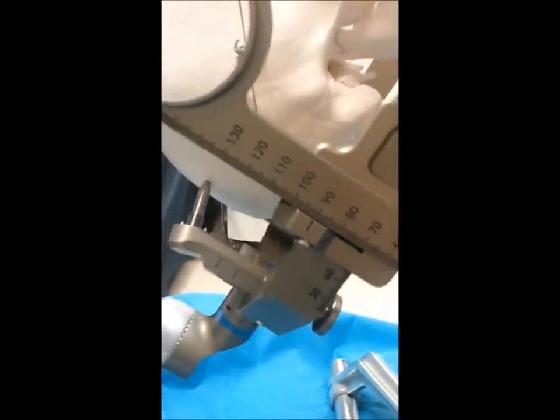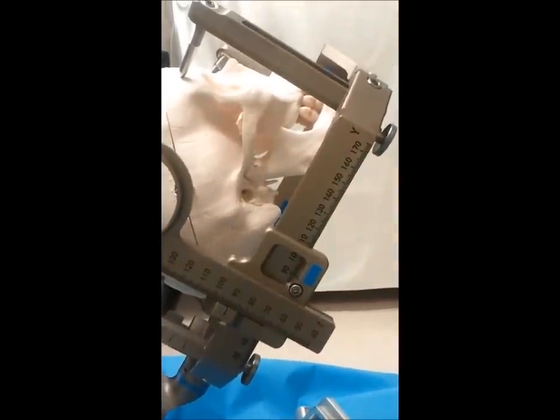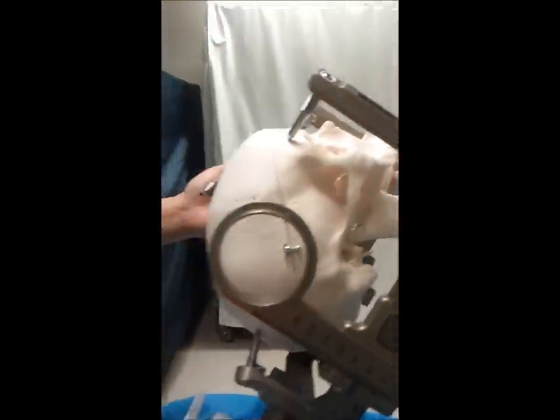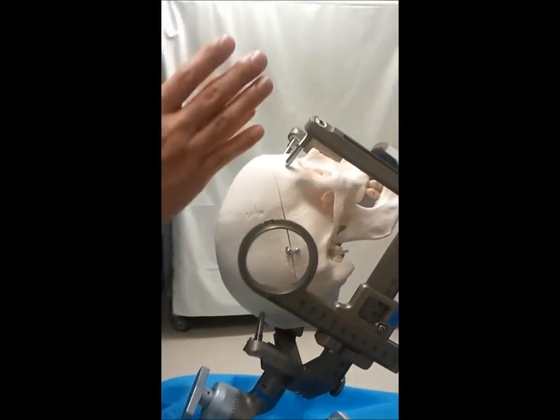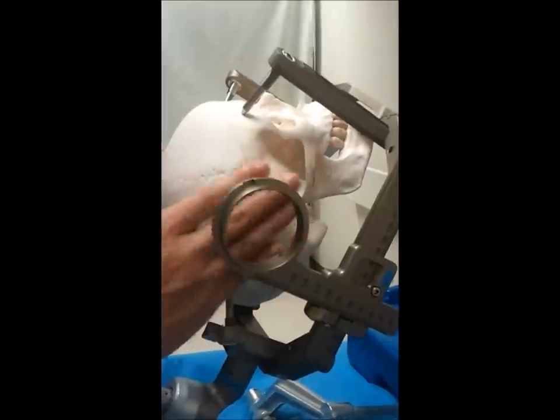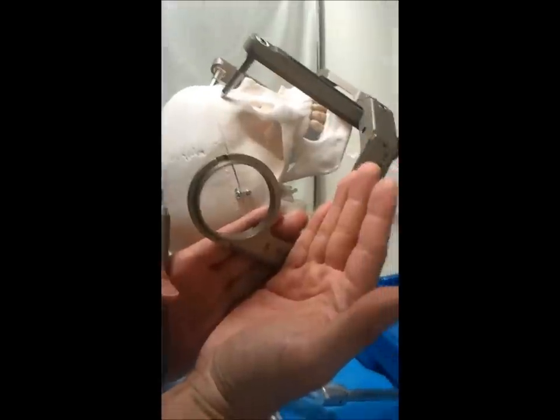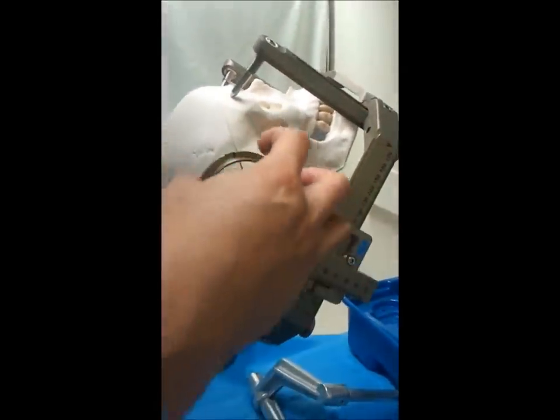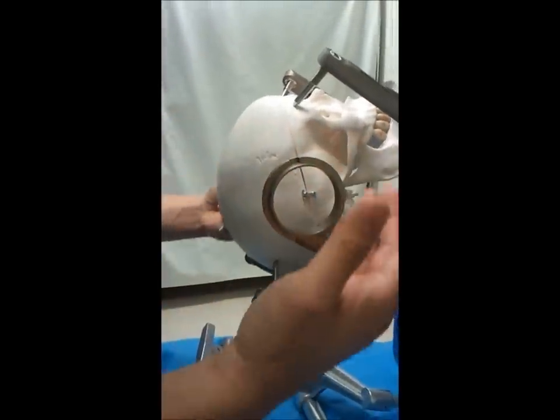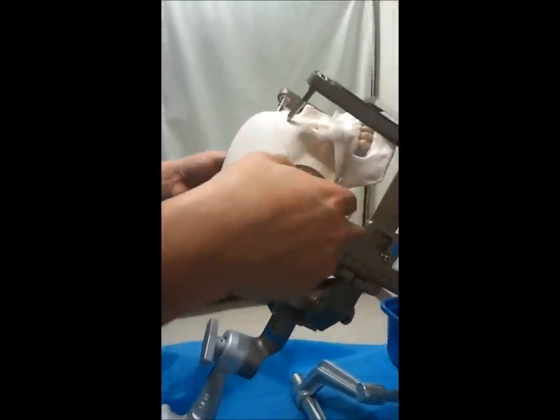The next portion of the procedure — the patient's already been prepped and draped before these go on — is to place the drape on whatever draping system you use. We use a large DBS draping system that Dr. Mickey will show you pictures of. When you place that drape in, you want a portion of the drape to go in between here, then have plastic that can easily be cut out and the drape go below this ring, because that's how we fixate the arc on. It's very important that the drape be done where holes can be cut so both rings are easily exposed — if that's not the case, it will be difficult to accurately proceed.